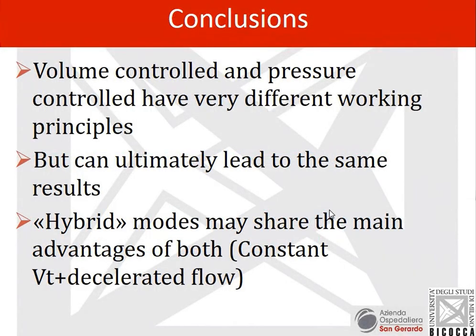So, going to conclusion, I think that volume control and pressure control make a huge difference for us doctors managing the ventilator, but perhaps if the tidal volume is the same and minute ventilation is the same, they will lead to similar results in terms of CO2 elimination, oxygenation and ventilator-induced lung injury. Perhaps we could have hybrid modes that could share the advantages of both, so a constant tidal volume and a decelerated flow.